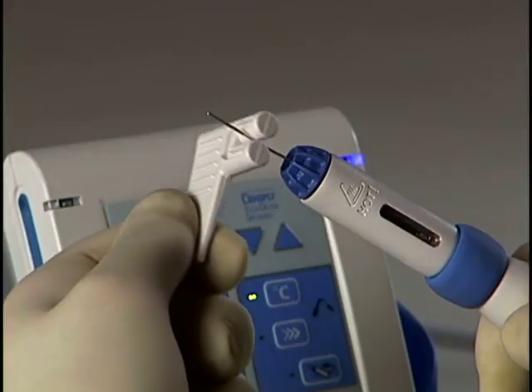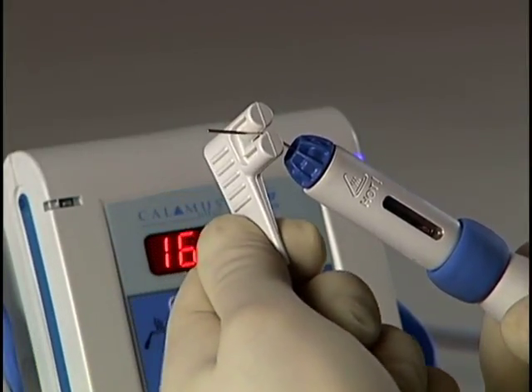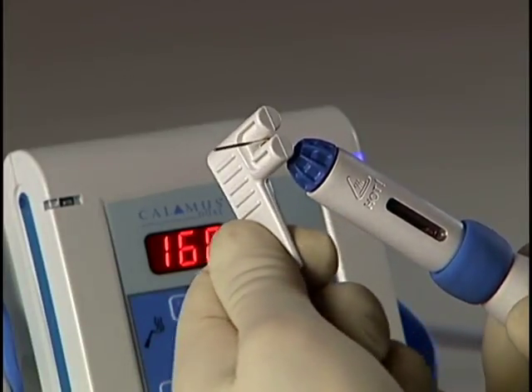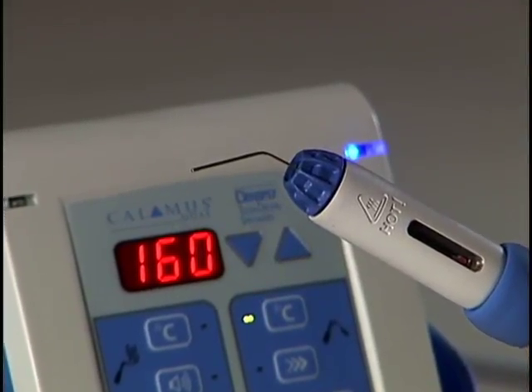Put the needle between the rounded knobs or bending posts so that the exposed end is slightly past the depth needed. Then gently twist the bending tool, imparting as much or as little angle as deemed necessary for the situation.